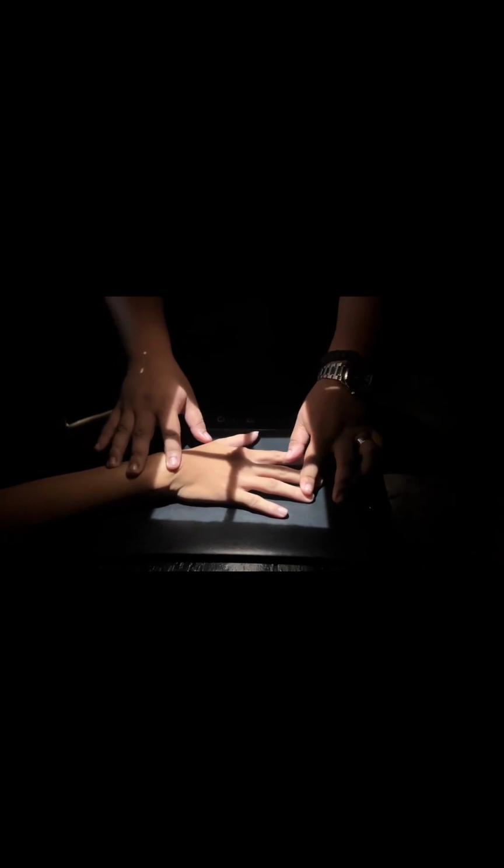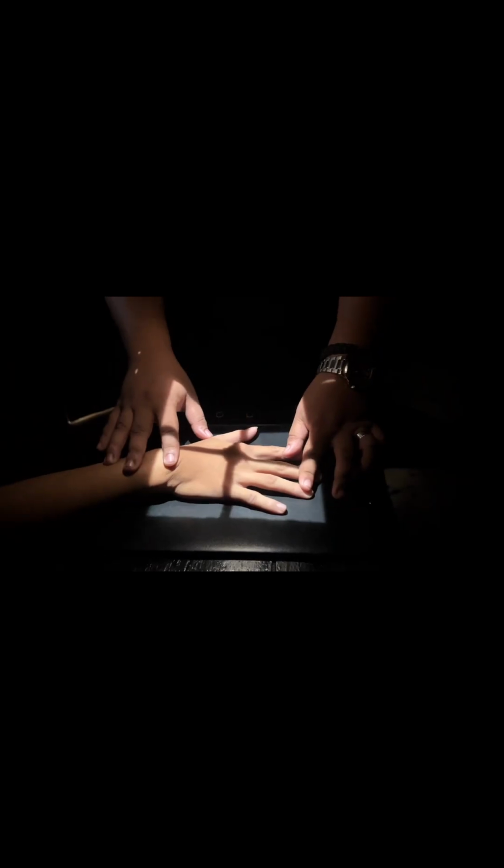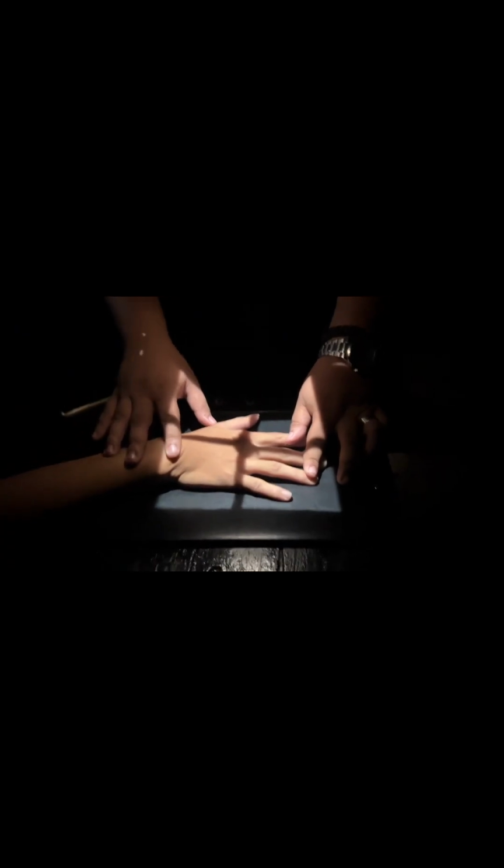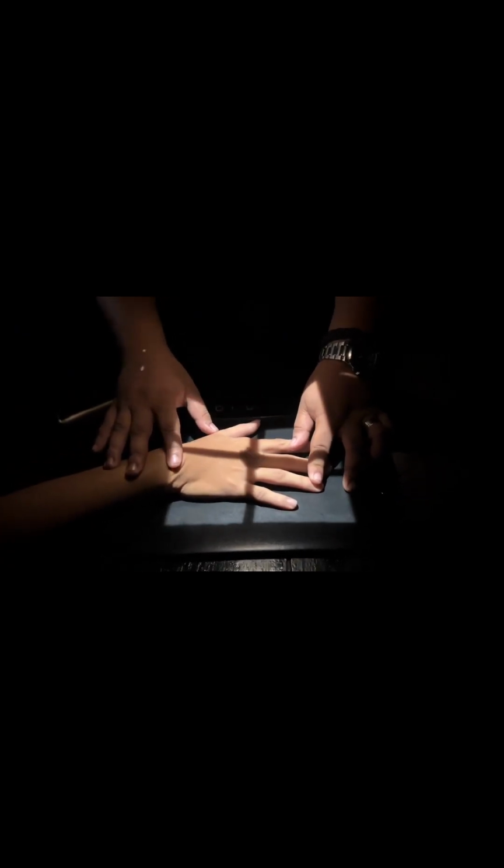The technical factors for this are SID 40 inches. The IR size should be 24 by 30 centimeters. The kVp should be 60 to 70 kVp. No grid, and the collimation is on 4 sides of hand and wrist.